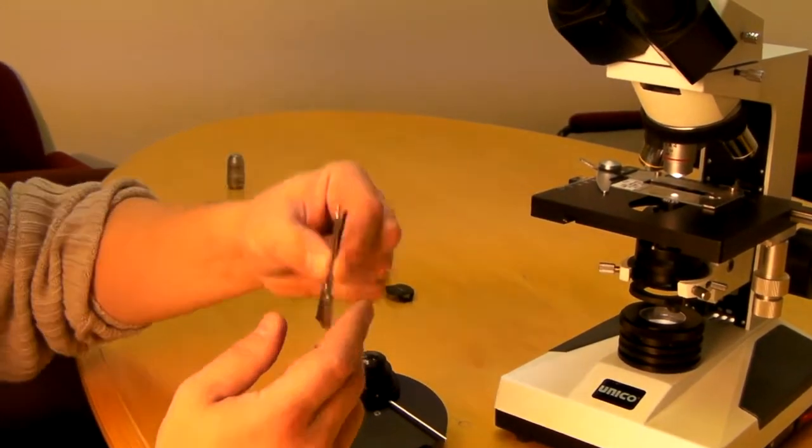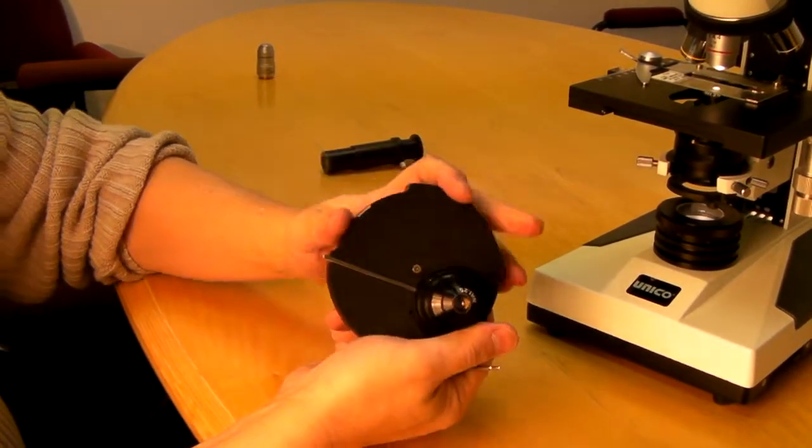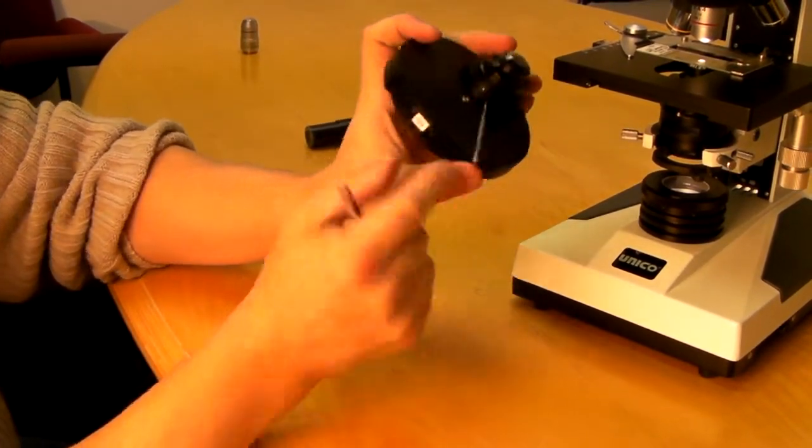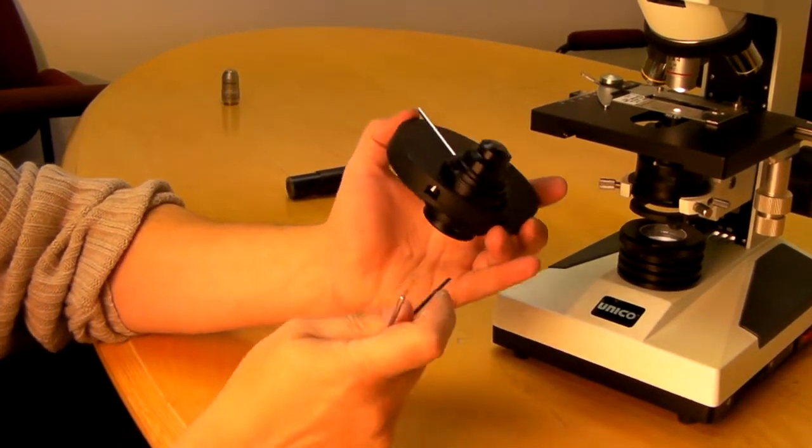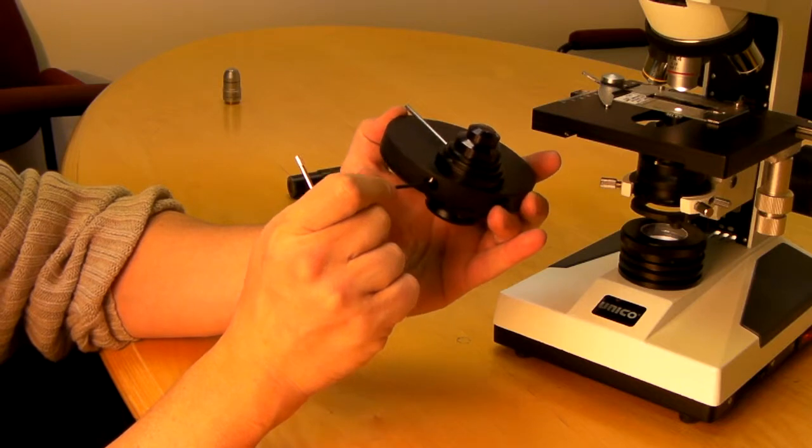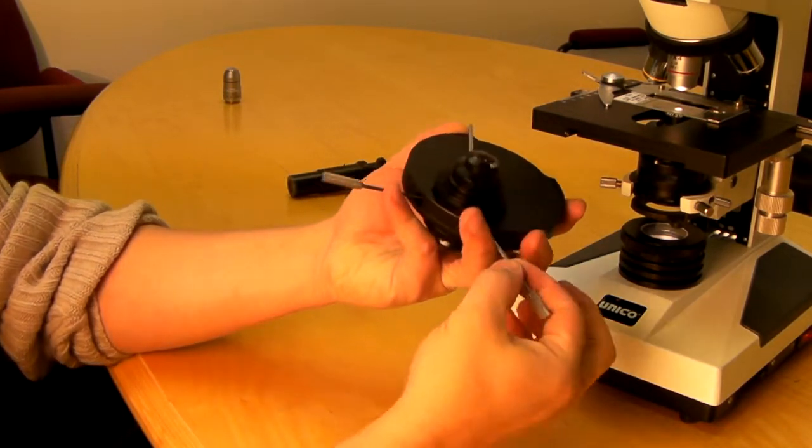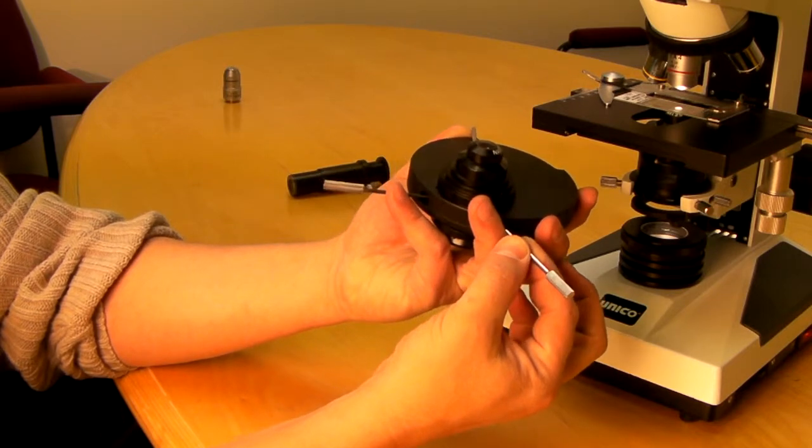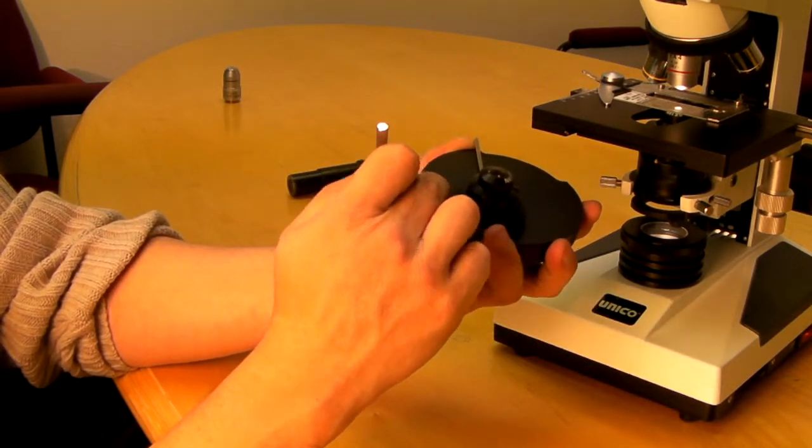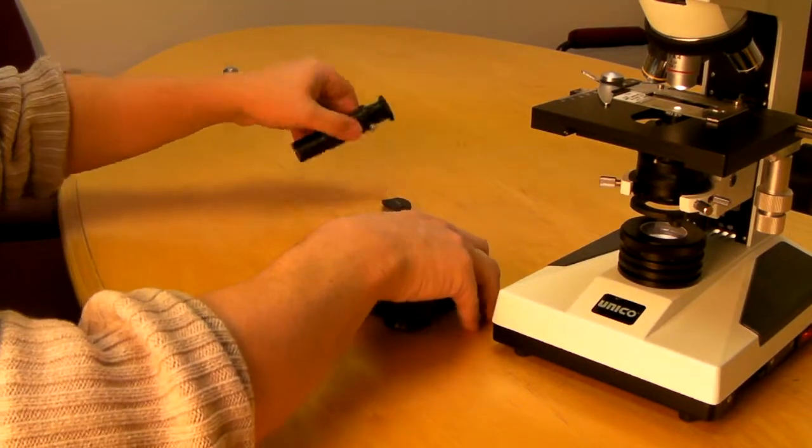You will also have two allen keys on the back of this condenser. When you set it, let's say to 10x, you will see two allen screws. These two allen screws can be manipulated by those keys to center the lens in its proper place. I will show you how it's done.